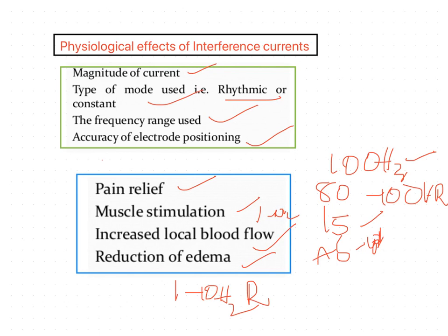So both of these factors will help absorb the exudate which causes the swelling. So once this exudate is absorbed, finally it leads to reducing swelling.